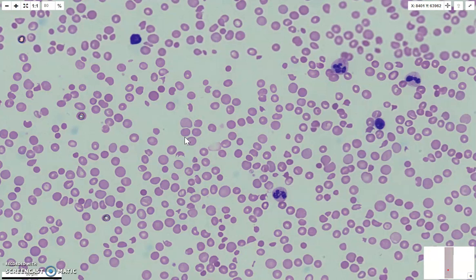14-year-old female with a white cell count of 10, red cell count of 2.2, hemoglobin of 66, low hematocrit, normal MCV, MCH, and low platelets. So remember, a MAHA basically is microangiopathic hemolytic anemia, and that's due to microocclusions or some blockages in the microcapillaries or the damage to some sclerosed vessels.